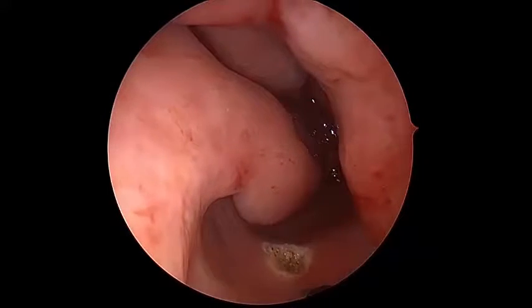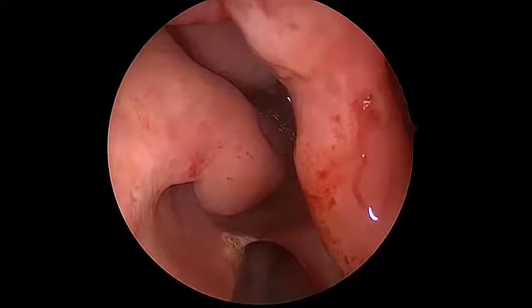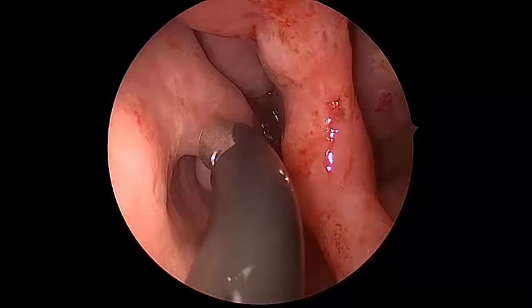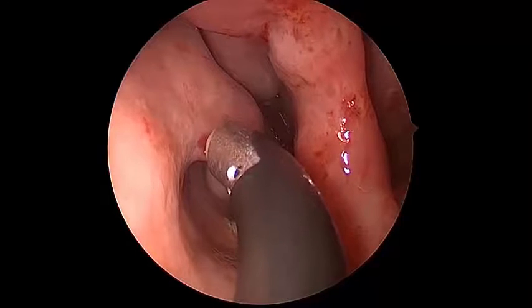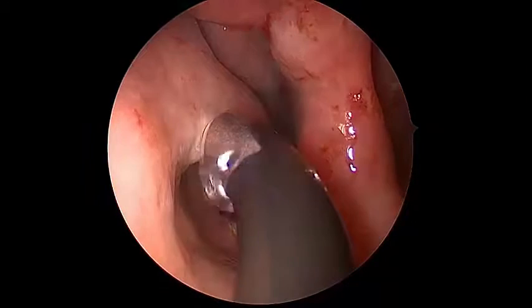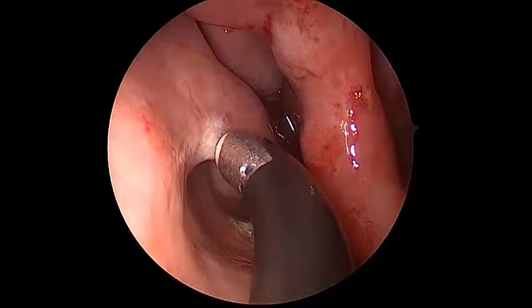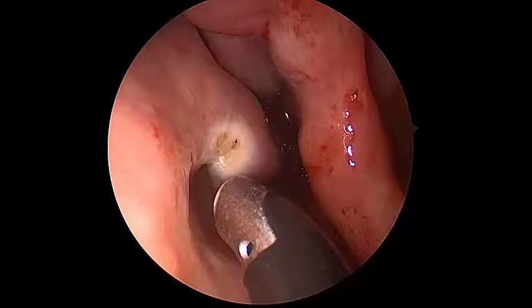This is the coblation setting on six or seven — typically works well. You'll see me rough it up and make sure there's nothing else bleeding, then I'll move on to other lesions. I'll usually start with the worst looking lesions first. This one is not particularly bad; it's easily coblated. You can see the saline going through the coblation because the saline carries the energy — it carries the ions. So it's always rinsing with saline at the tip.